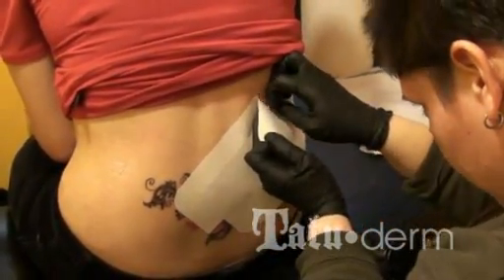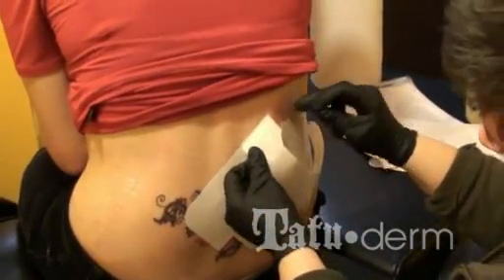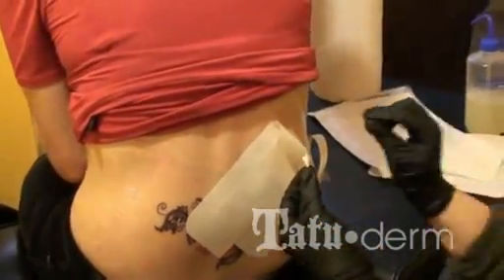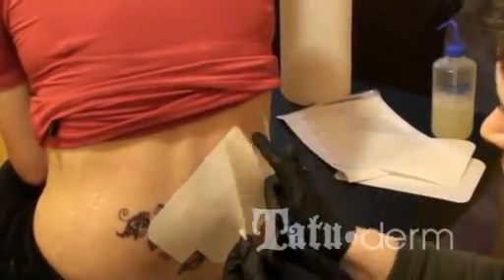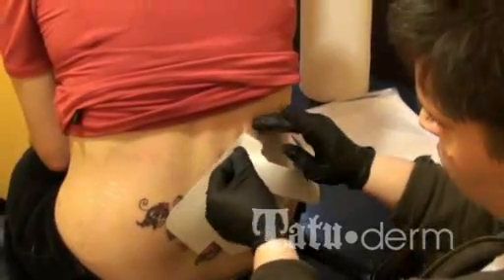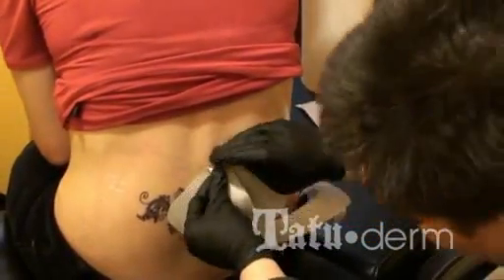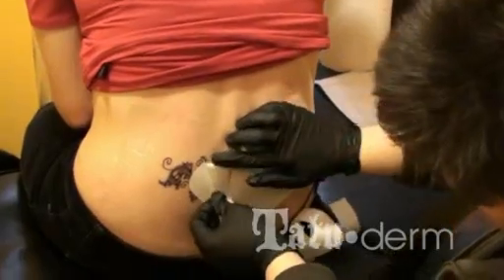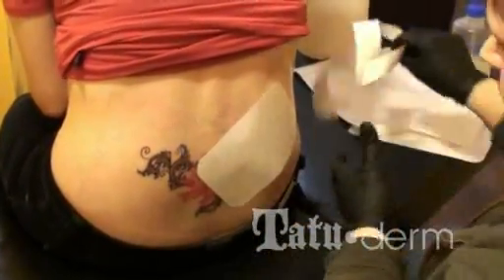Sometimes you get a little rip in the paper, but that's okay. If a lot tears away, just take a little bit of alcohol on a swab, soak it on, and it'll rub right up. It won't go through the tape because it's a one-way barrier, so there won't be any stinging or anything on the tattooed area.